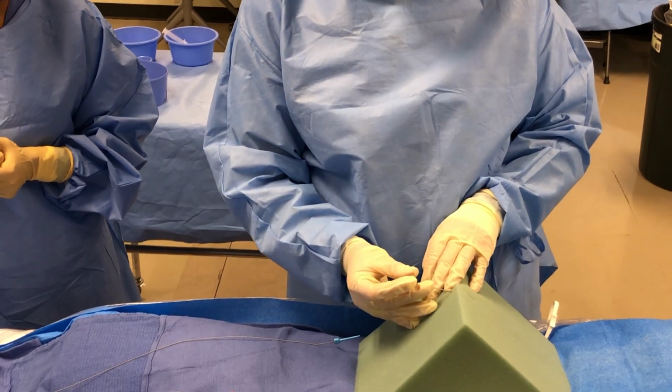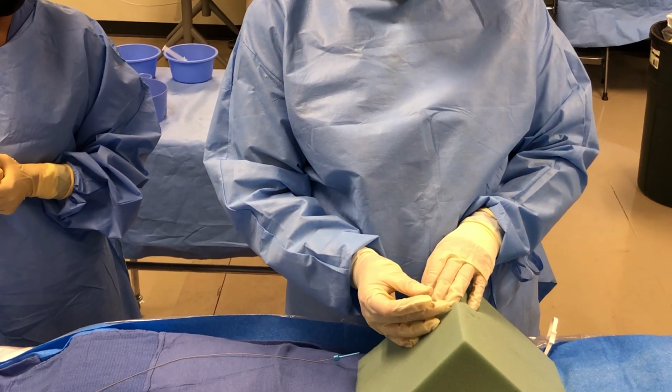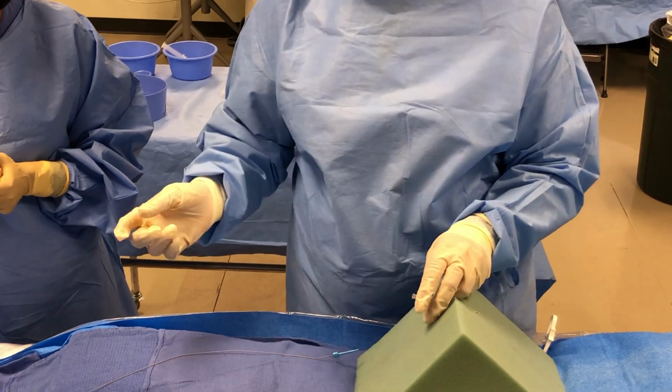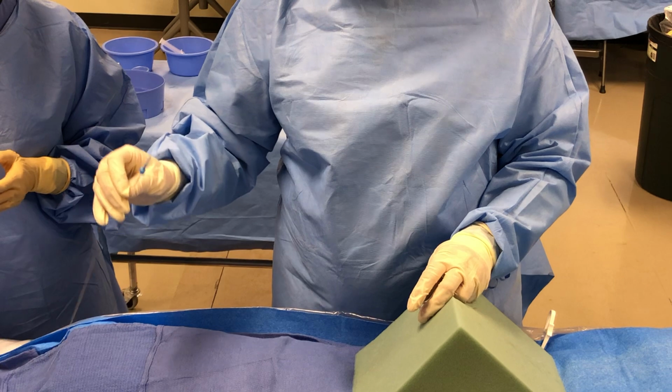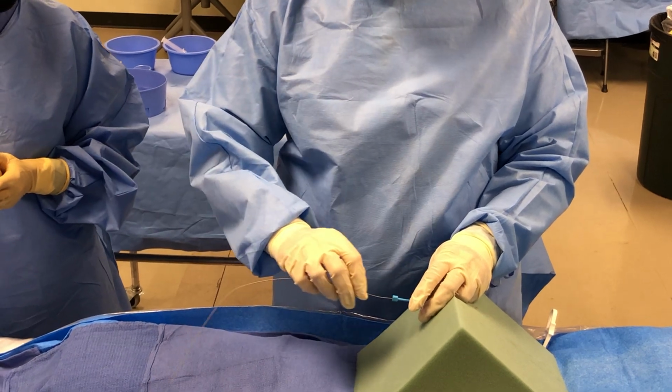Once they hit the artery, blood should start spurting out, okay? At that point, then the doctor's going to reach down and get their wire and stick it in.